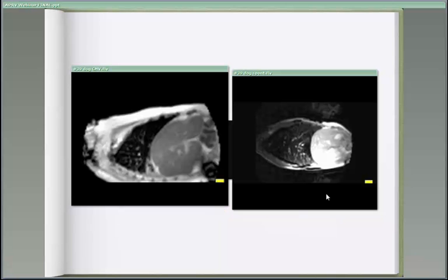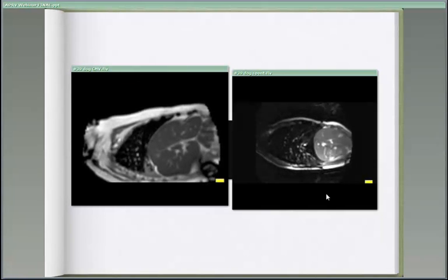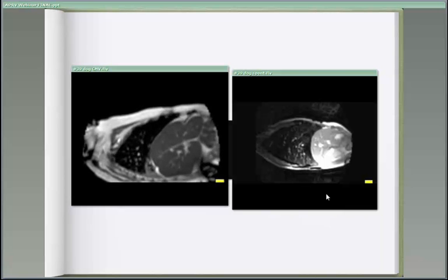This is conventional ventilation, paralyzed, and hopefully it'll be playing here. And you can see that there's already some basilar atelectasis here. You can see also that the anterior chest wall moves very easily, has a big excursion, and you can see this on your patient. As the gas distribution is progressively non-dependent, you will see more swing in their anterior chest.